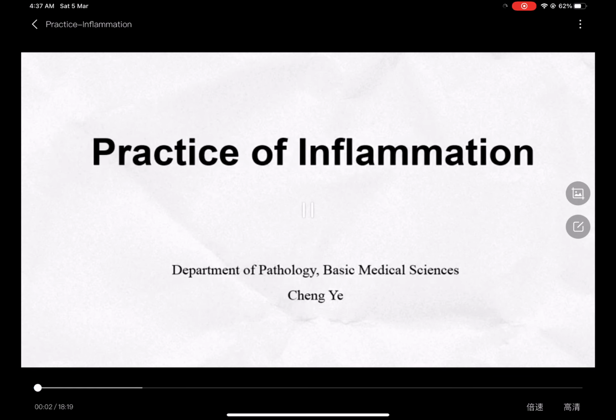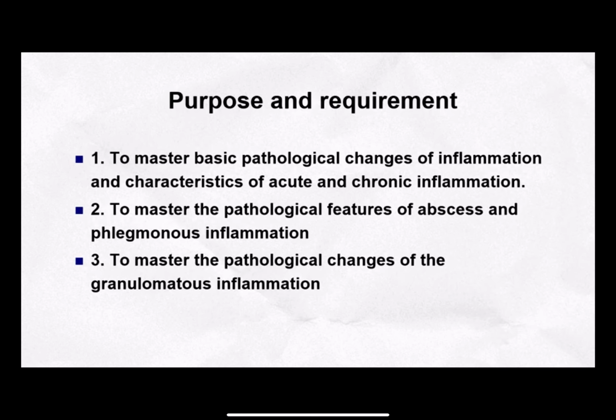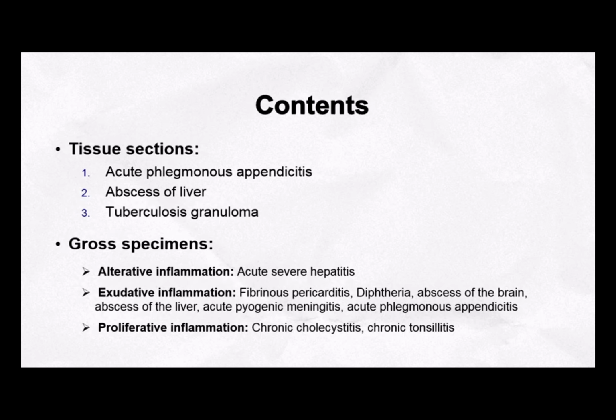Hello, today we are going to study practice 4, inflammation. Here is the purpose and requirement of this lesson. Today, we will observe 3 tissue sections and several gross specimens.